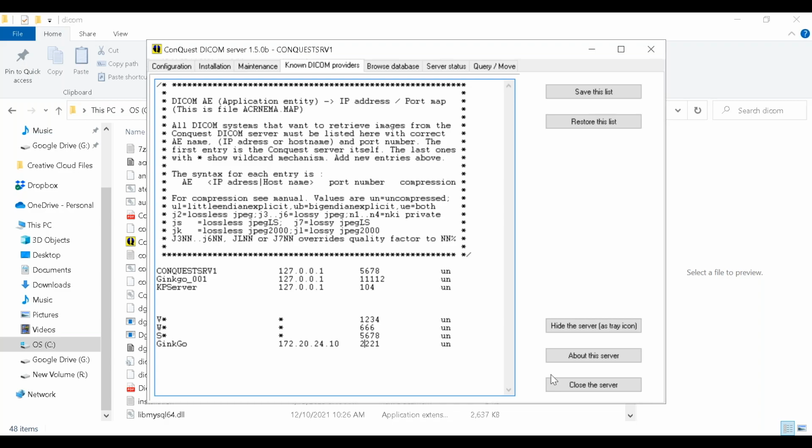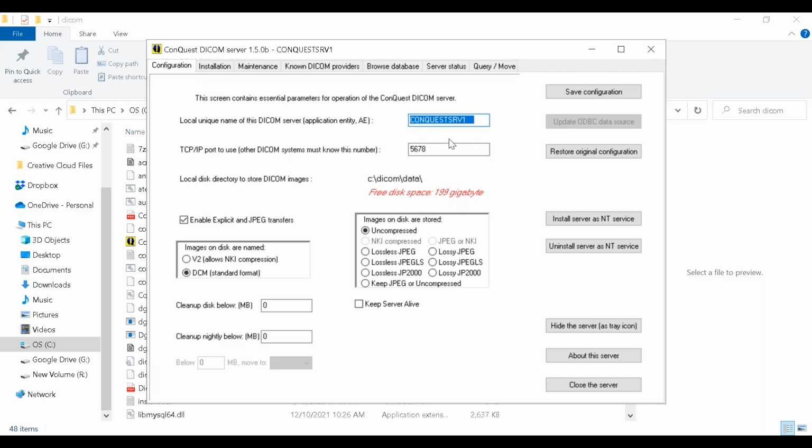Well, where do I find this software's AE, IP, and port? Well, first off, let's start with the easy one. IP, what machine is it running on? Same one, right? So it's running on the same one. If you click here in configuration, notice here it says AE title. If you can see that, that says AE title. And here my AE title is ConQuest SRV. A lot of people sometimes put SVR because server seems a little bit more comfortable to them, but hey, no, not to this programmer. They like SRV, right? So that's the default. And then it's just number one. And then for the port, notice the port is 5678.